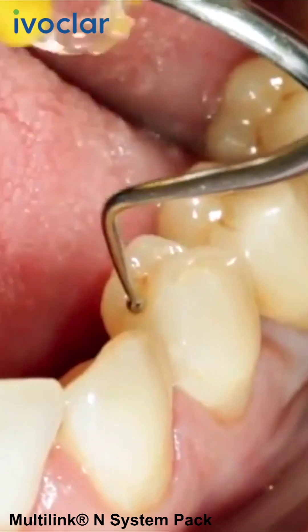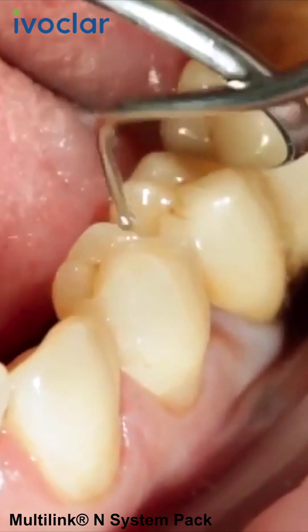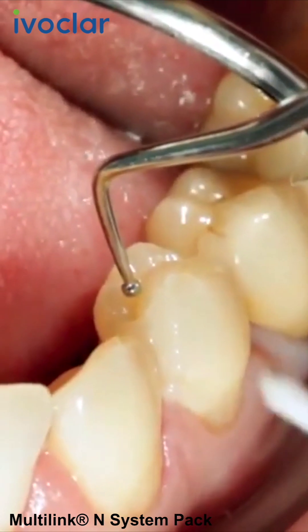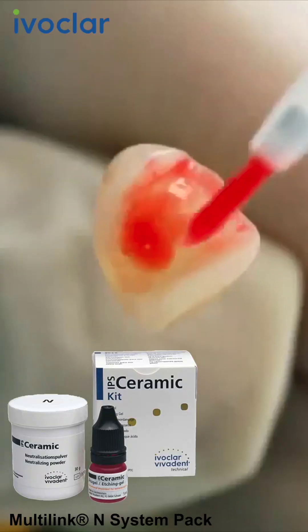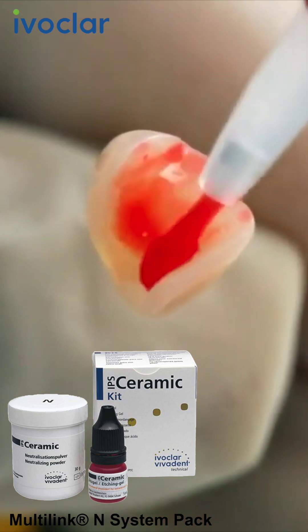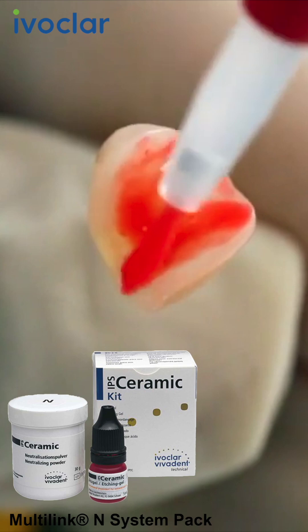When trying in the permanent restoration, check the shade effect, the accuracy of fit, and the occlusion of the restoration. Etch the bonding surface of the restoration made of IPS e.max with 5% hydrofluoric acid, such as ceramic etching gel, for 20 seconds.